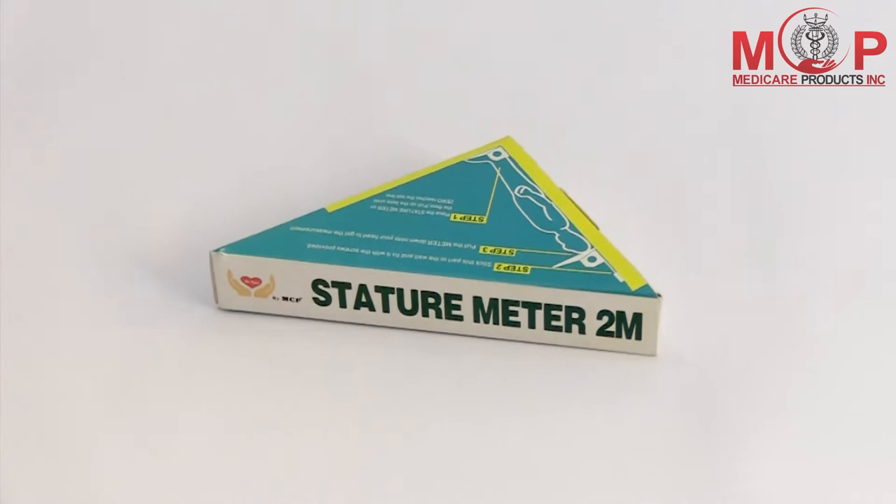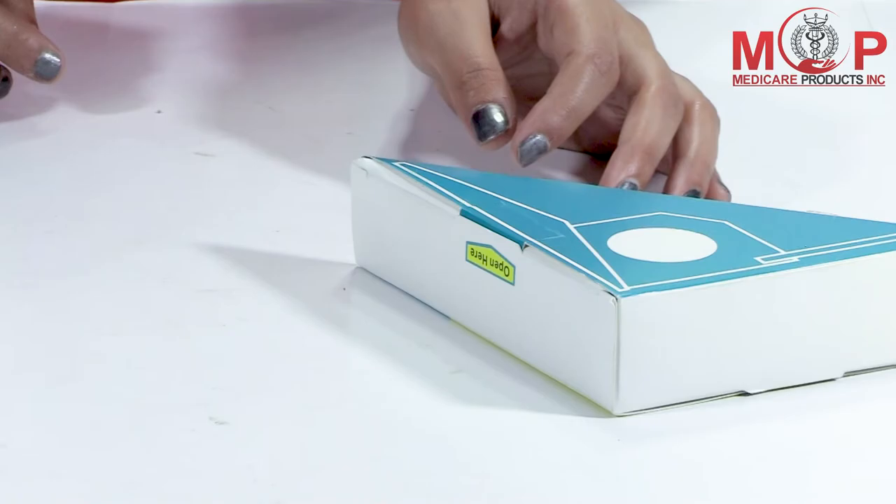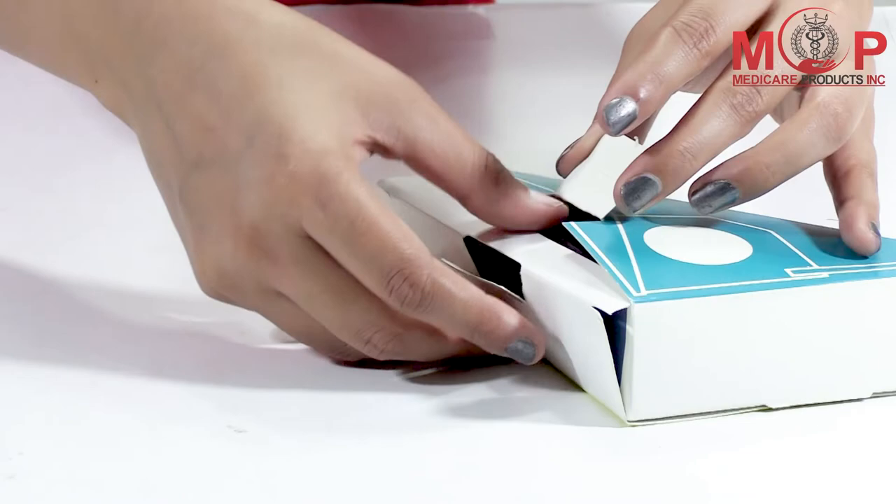Presenting the MCP wall-mounted stature meter height measuring tape, 200 centimeters or 2 meters. It can be used to easily measure the height of adults and children at home, office, clinic, school, and more.